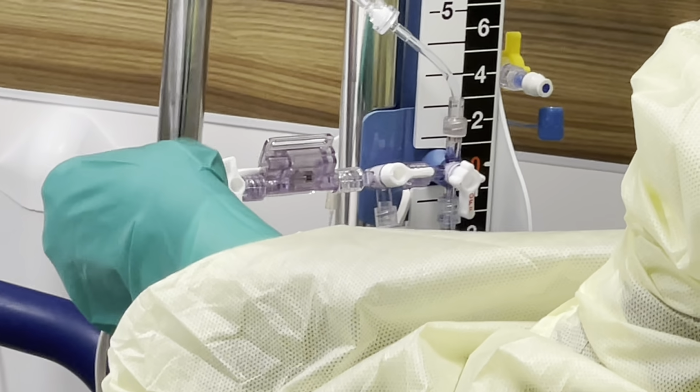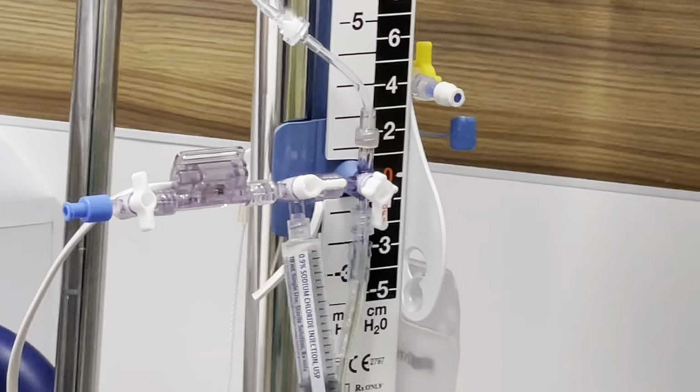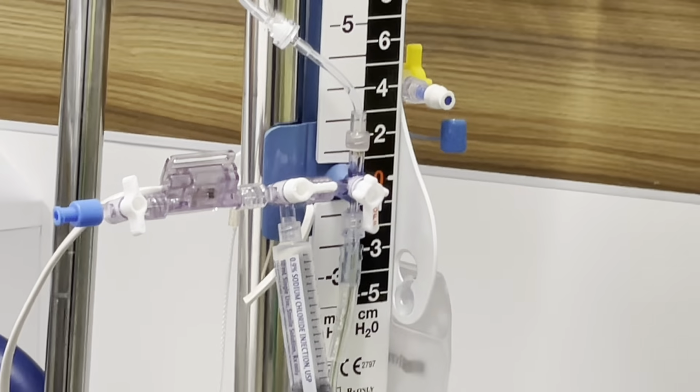Okay, sterile. Now, before we flush to the drain, we're going to make sure we're off to our patient. We're going to turn this all the way over. What we're doing here is priming all of this so it can go into the drain, so that we have our transducer and our whole system primed. This, from the patient on downward, should have already been primed by the neurosurgeon. If for some reason there's any error in this line here, that's not for us to do, that's for the PA to come out and do. So we won't worry about that. We're literally just worrying about where the transducer is flushing to the drain system.